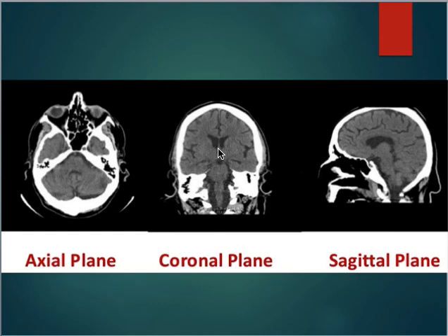So from the anterior to the posterior side, this is more of the posterior portion, so you can see the brain stem down here. And then you have your sagittal plane, which is the side view, right? So any plane that divides the body into right or left halves. The CT machine is capable of scanning in all three of those planes, just the most common one is the axial plane.